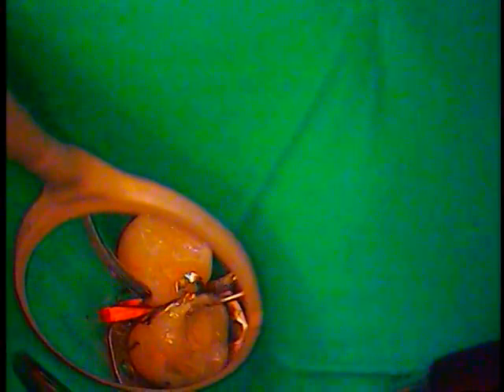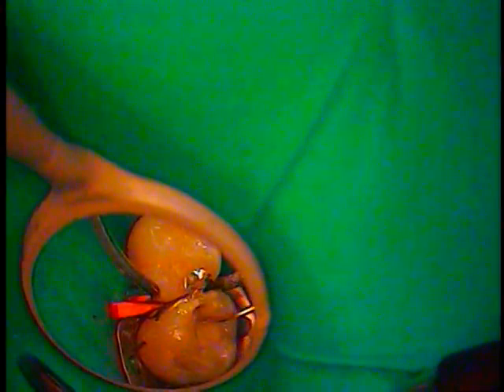Now I'm building into the contours using a flat instrument. I'm pushing it like a paddle up against the wall. And then you can switch it and go this way. So you're filling like a funnel.